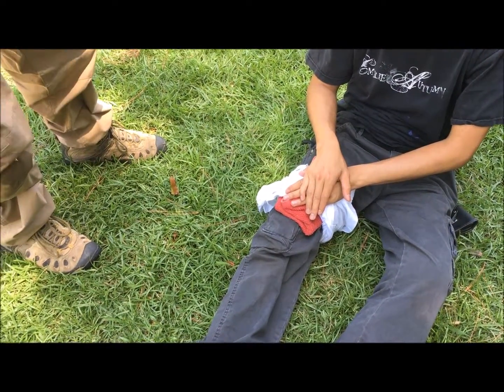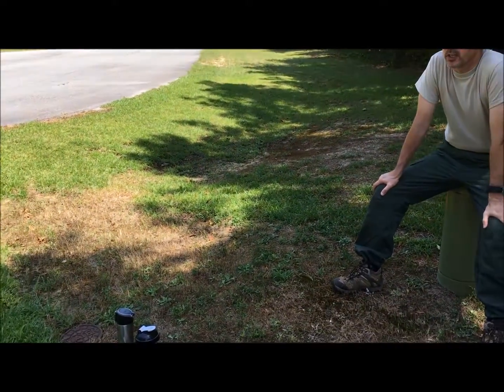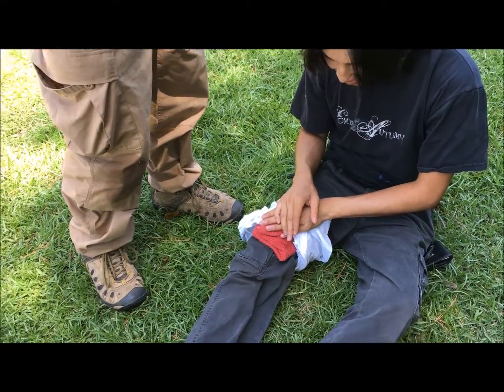Just wrap it down, put the knot over the wound. Now you say never take it off. What if it soaks through with blood? You keep putting more on. Then you just put another one on top of it? And the pressure never comes off, because it'll just open up again.